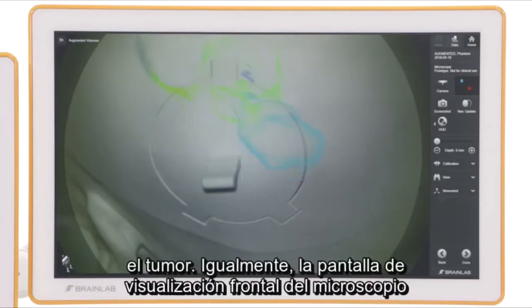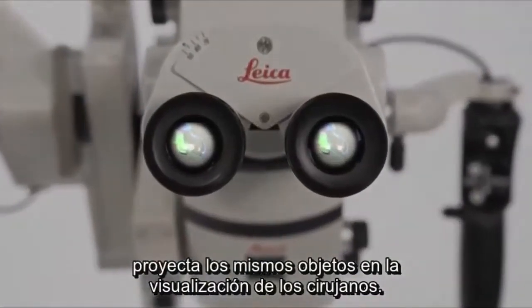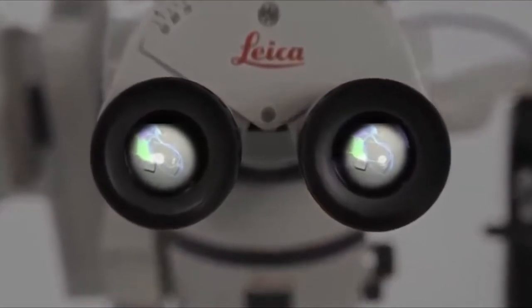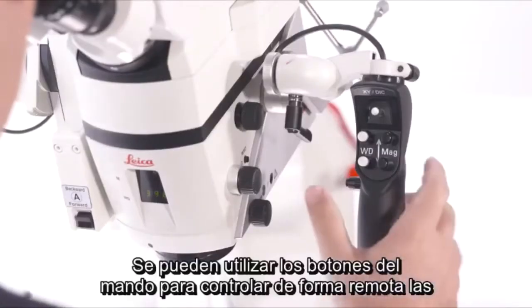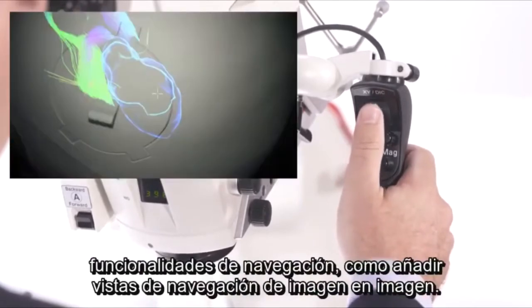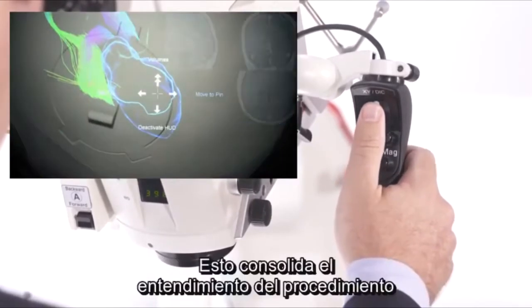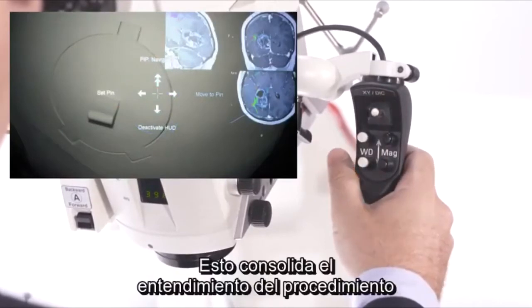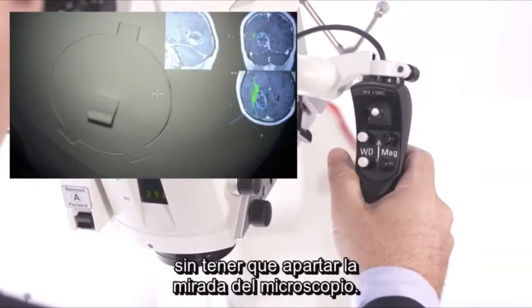Likewise, the microscope head-up display projects the same augmented objects into the surgeon's view. Handle buttons can be used to remotely control navigation functionality like adding picture-in-picture navigation views. This consolidates procedure-critical insights without the need to look away from the microscope.